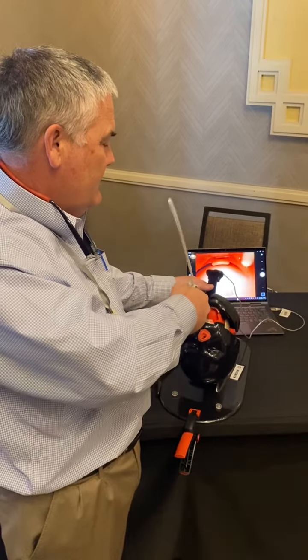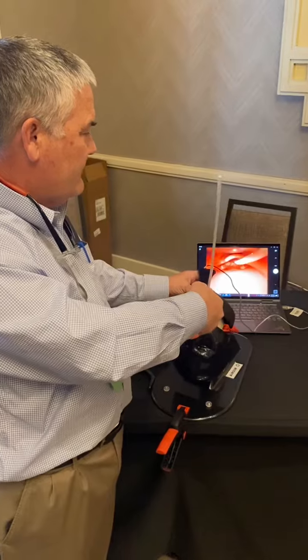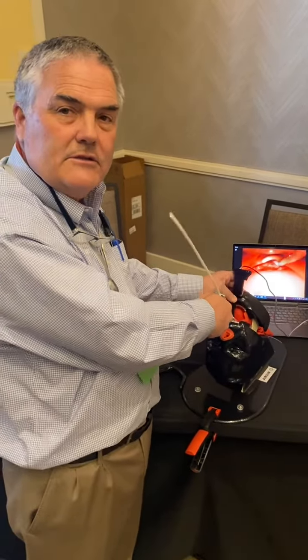Straighten the tip and release the tip, and then you'll notice it's exactly midline. I find my view very easy to access.